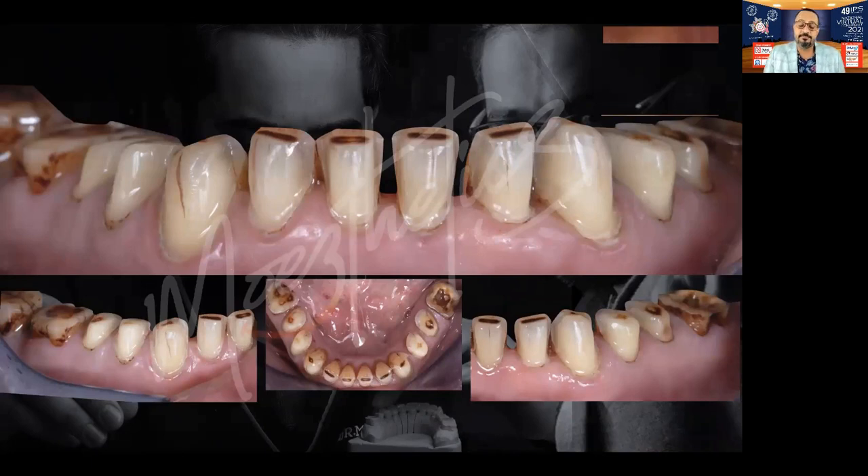These are the final preparations for this patient. Lower anteriors are all just veneer preps — extremely conservative in nature. Posterior preps are either V-tops, where you have a buccal preparation and an occlusal preparation, or classic occlusal tabletops, which is just a biting surface preparation. No teeth were endodontically treated here, excepting the lower left six, which was already treated before. For this tooth, we did an endocrown preparation — we did not build the core up with composite at all. We just prepared the cavity and made the final impression.